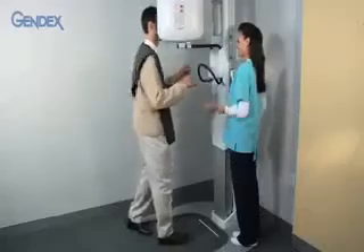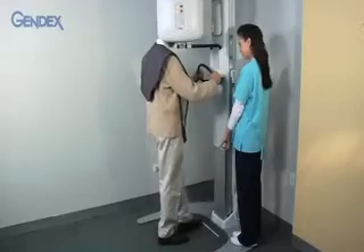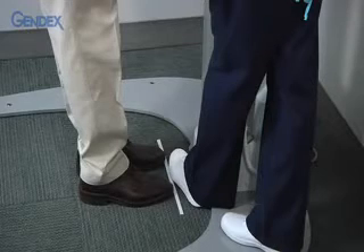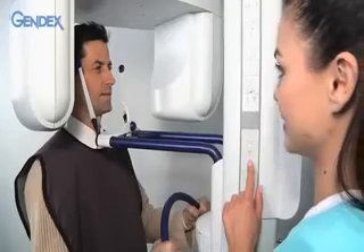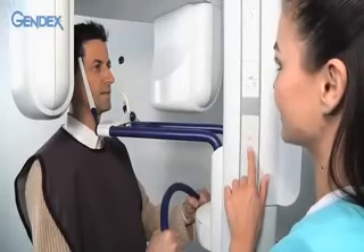Ask the patient to step forward into the unit with his head between the head support arms and to grasp the handles, then to move his feet forward. It may be helpful to place a marker on the floor or to use your foot as a guide. The patient's body should be straight with the upper body slightly slanted backward — this position stretches the spine to minimize its shadowing on the image.